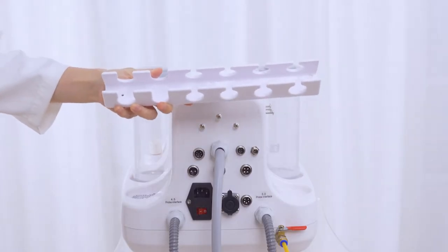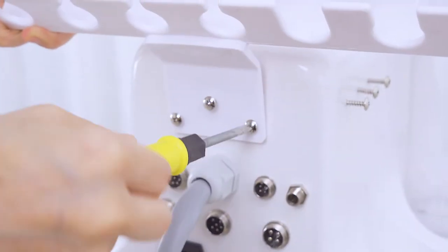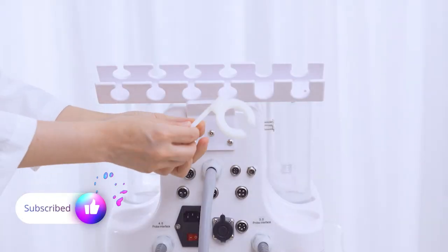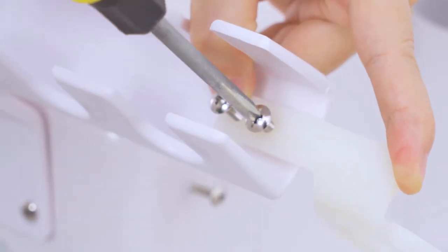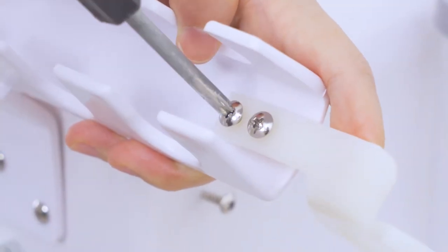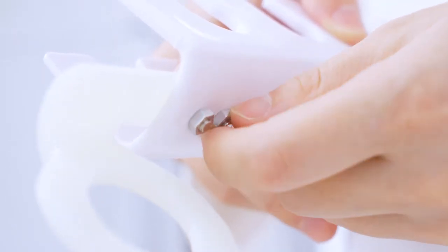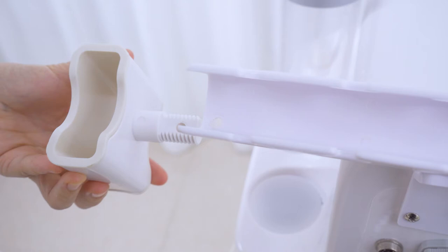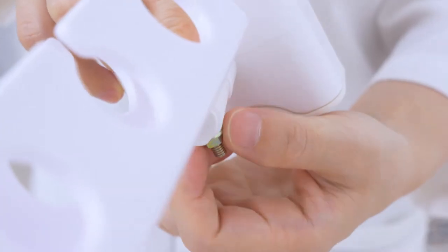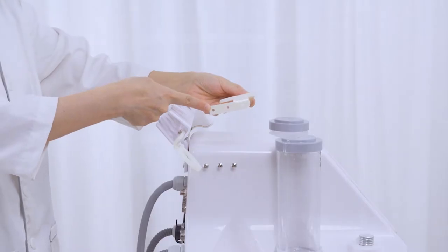Take out the screws and start to install. Aim the handle holder at the right place and twist the screws into the machine. Install the round accessories hanging rack on two sides and the oxygen spray handle holder.